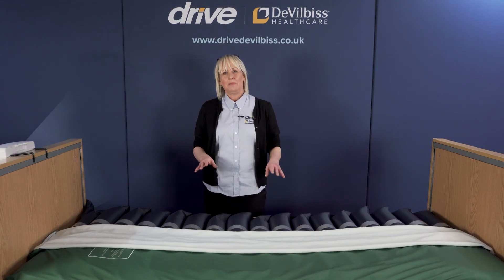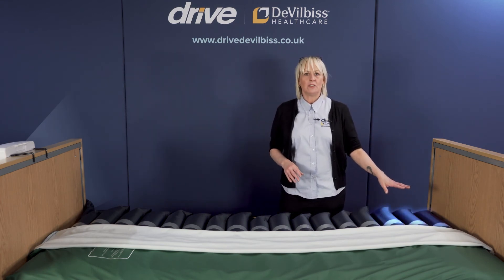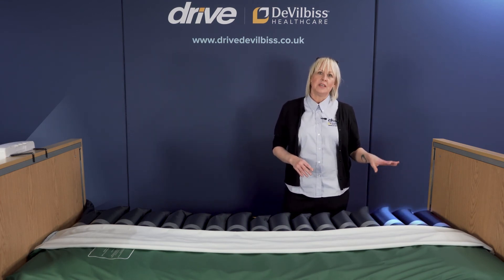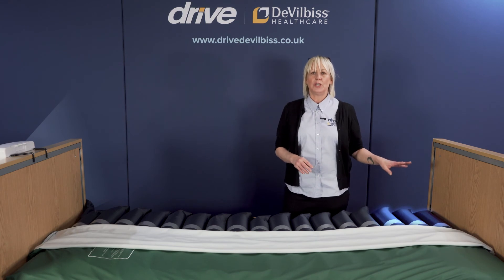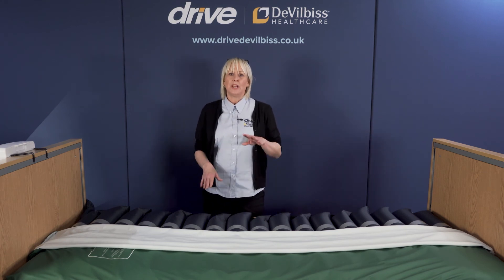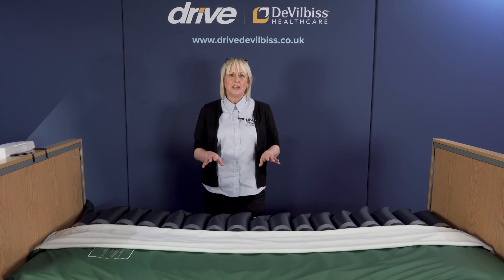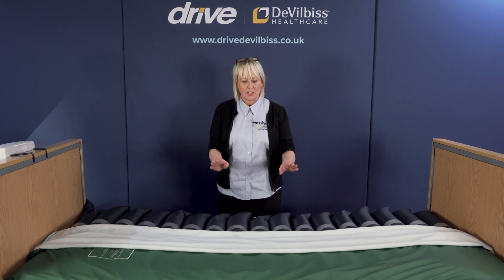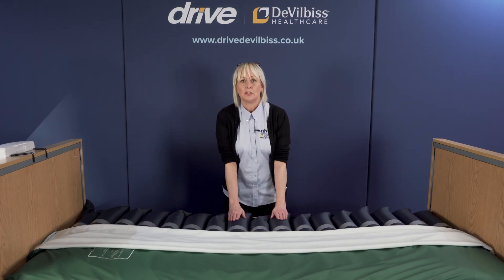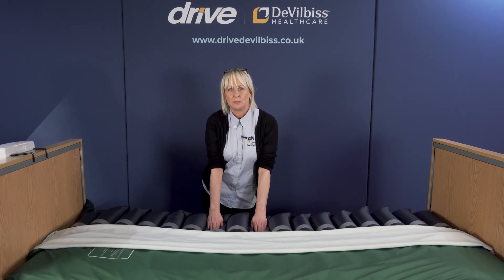The AirOnFoam mattress is comprised of 17 individual cells. The top three head cells remain static at all times, to reduce any feeling of nausea or motion sickness experienced by the user. The remaining 14 cells operate in a two-in-one cycle over a 12-minute period, meaning that at any one time the patient experiences 50% support on the body and the other 50% of the body experiences pressure relief.